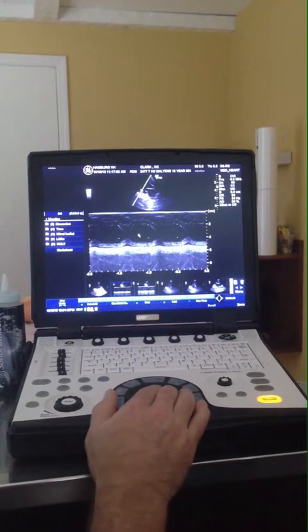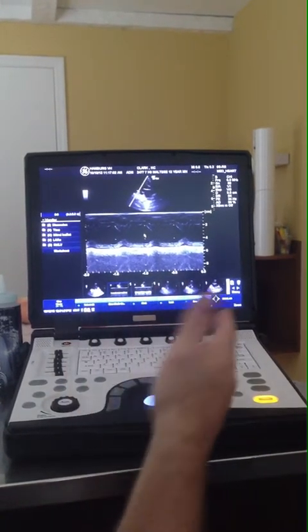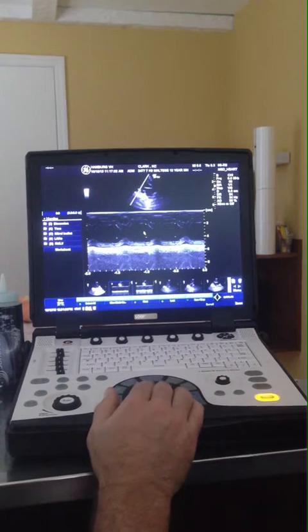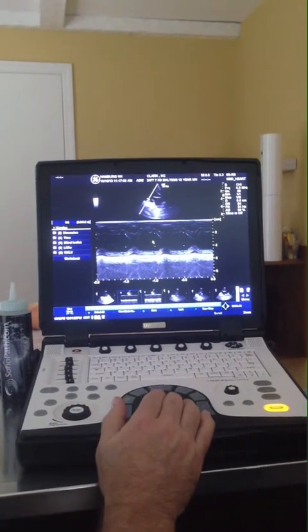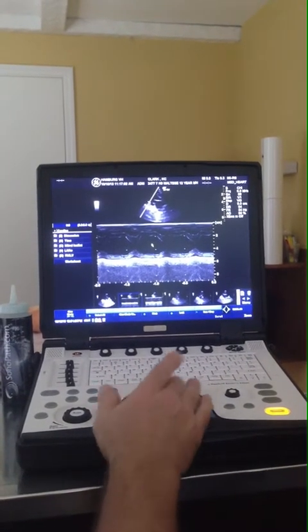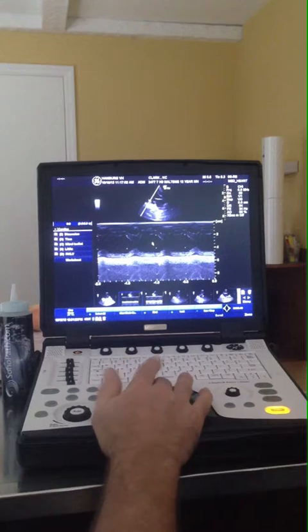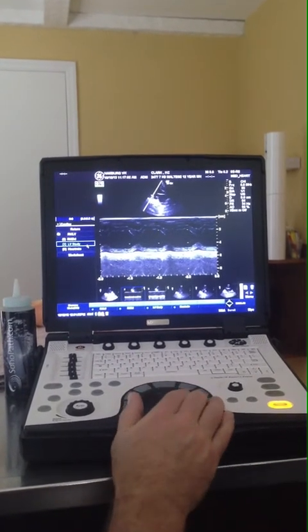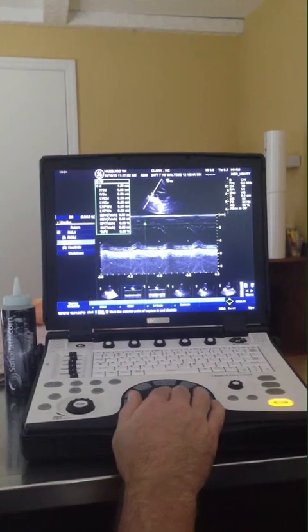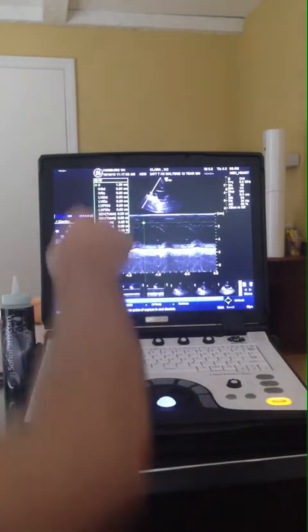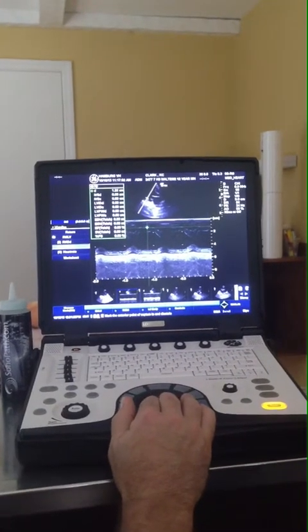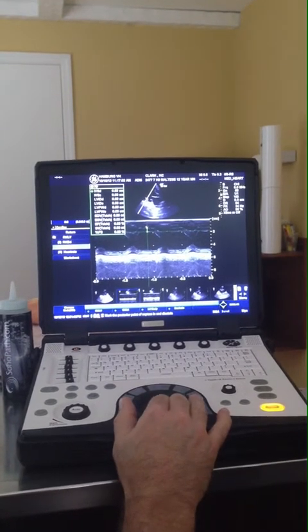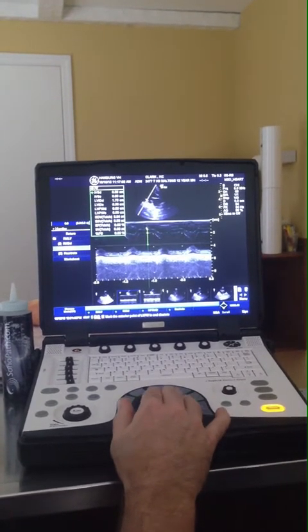Given the animal is in respiratory distress, we got what we needed and saved it without taking time doing measurements there — we can do it in post-processing. We push measure or calcs right above the trackball, go to LV study, and get this drop-down menu. We go to septum, leading edge to leading edge, then internal diameter.